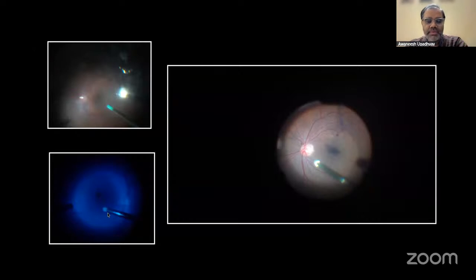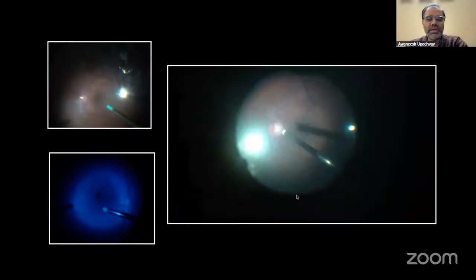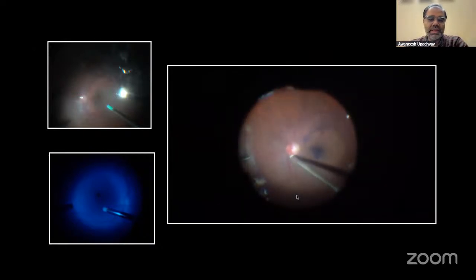So because of this valving, the size of the fluid stream has gone down. So I prefer what Dr. Mohit was talking about, and this is where I tend to do it, especially in conventional techniques. I couldn't get a video where I'm actually using a cutter, but I prefer using a cutter. I think Dr. Sisher would agree.